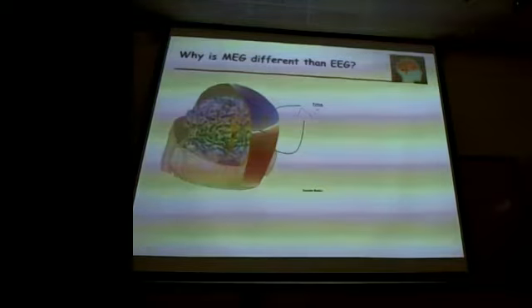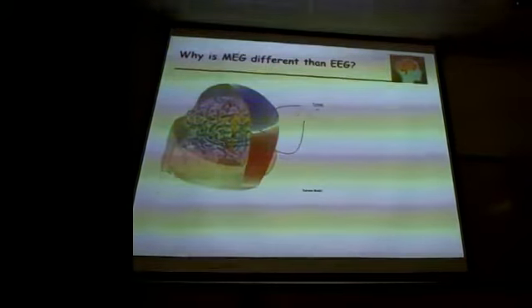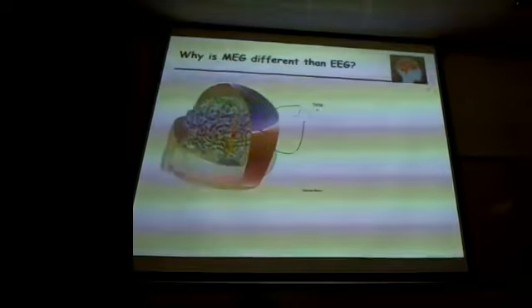Why is MEG different from EEG? They're really measuring the same underlying activity, which is what we're showing here.